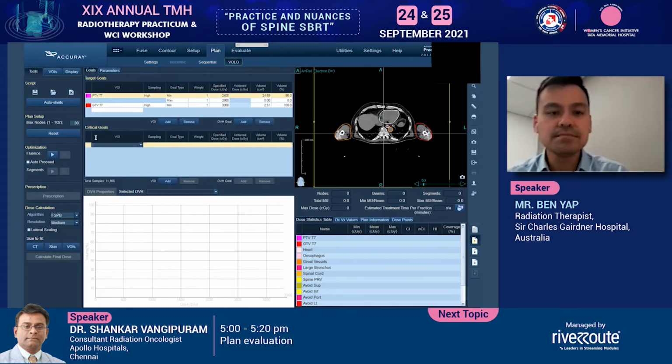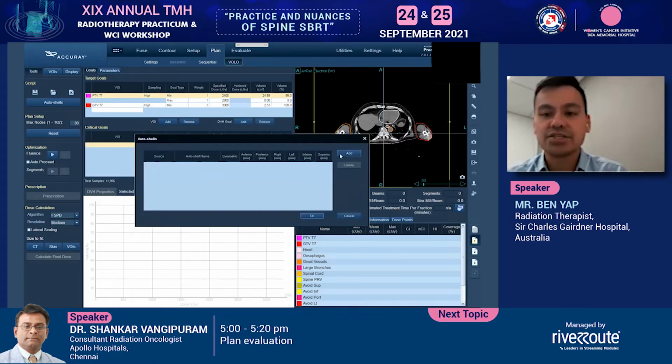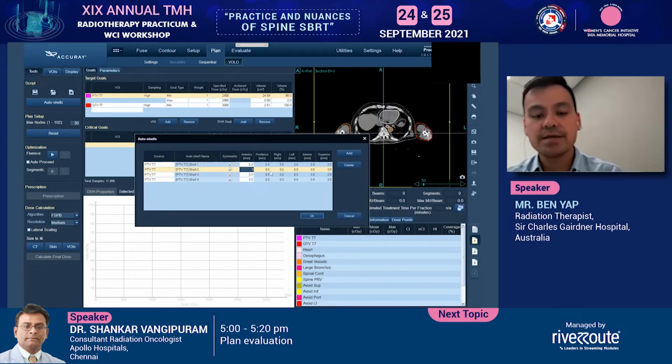98%. The next step is to add these shells. So I like to add 4. You can add 3. You can add 2. My advice is that you start simple and you work your way up to complexity.